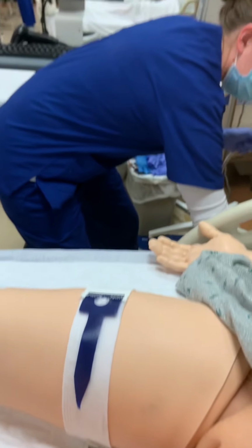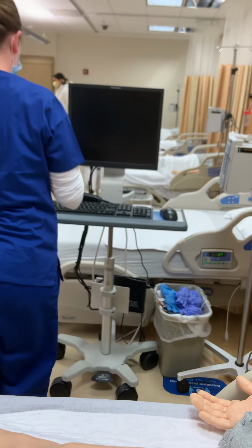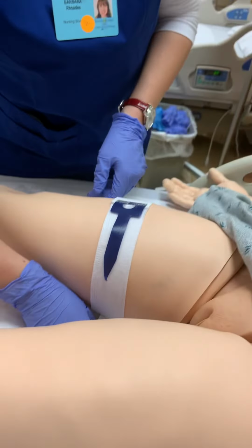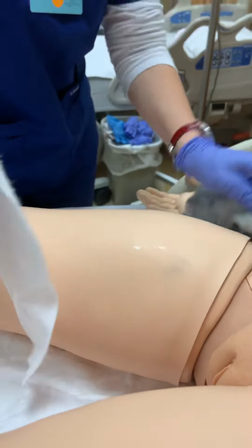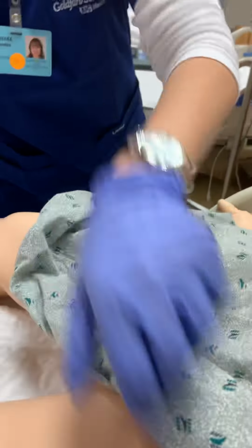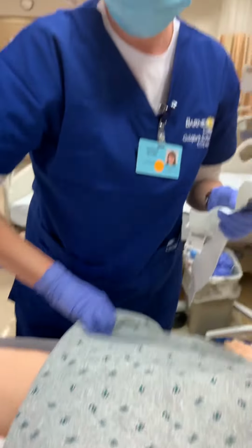And I can dispose of this entire thing in the trash can. And I will move your gown down now. Went ahead and checked for skin integrity where this was to make sure that there were no issues from having this around her leg.